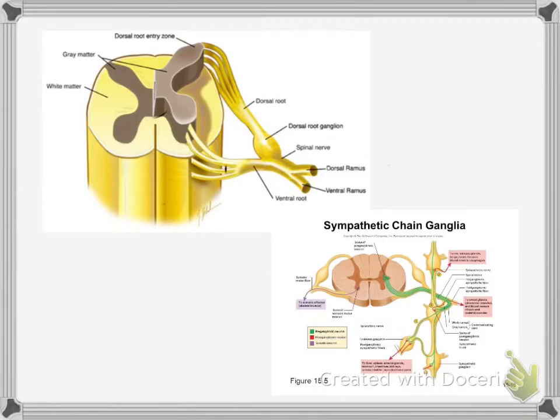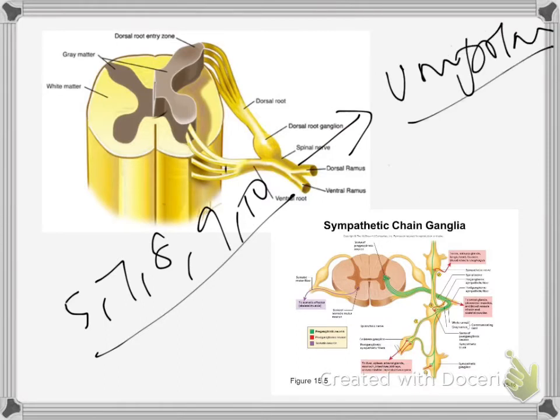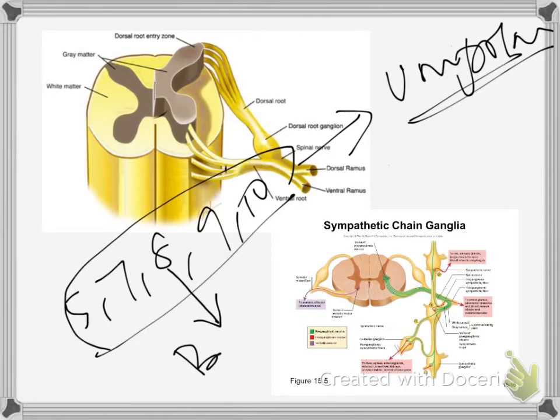What is that? So I have told you 5, 7, 8, 9, 10 cranial nerve sensory ganglion are unipolar, except one. You might have learned about what is unipolar and bipolar. So all these neurons are unipolar, but this alone is bipolar. Okay, bipolar. So this is MCQ, bipolar. So you have been given examples of sensory ganglion and you have seen what is called sympathetic ganglia.